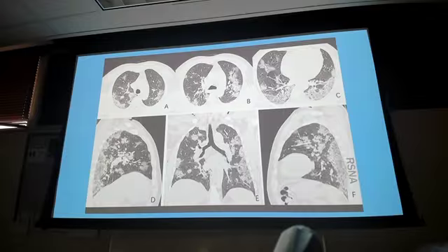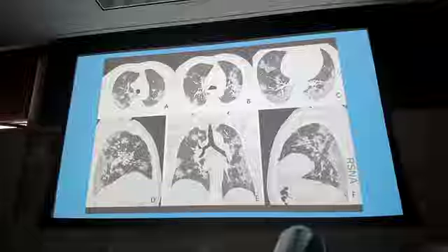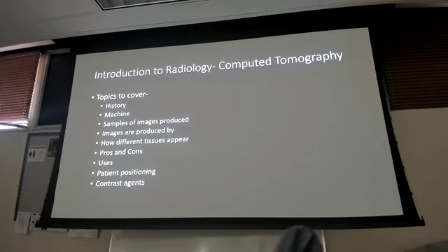But either way, just look at the amount of detail we can see on this compared to the couple of chest x-rays we saw yesterday. There wasn't tons of detail in there, it was a good generalized study, but this really gives you a whole lot more detail. We will get into that when it's time, but it just gives you an idea of when I need that higher detailed study to be able to diagnose what I'm looking for, my concerns, why a CT comes into play. That's everything we're going to cover.